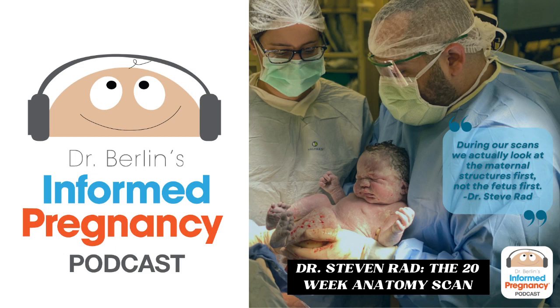You could do an AFI at 20 weeks, but typically to do an AFI, a uterus is divided into 4 quadrants. The uterus isn't that big at this point. You could do one in theory, but the more proper thing to do is to just measure the deepest pocket. There have been studies showing that there's no difference in outcomes or significance between deepest pocket and full AFI. So even before those studies, we never really measured an AFI at 20 weeks. Some fetal centers or specialists may do that, and you can still do that. And still the range is the same, 5 to 25. Okay. So that is the fluid.